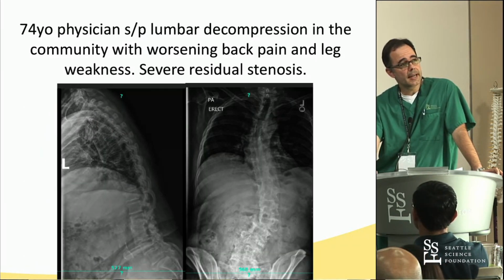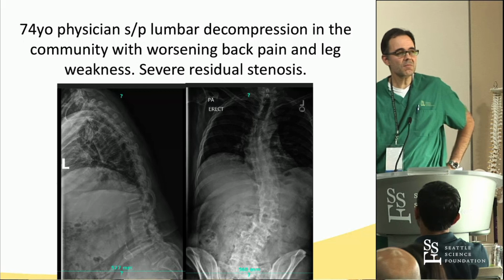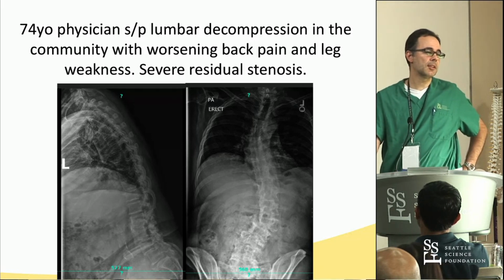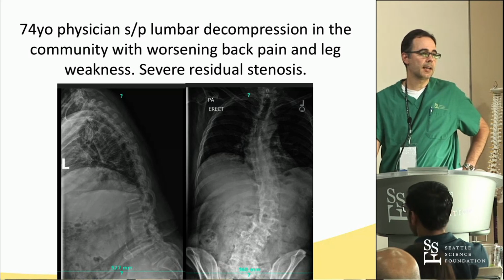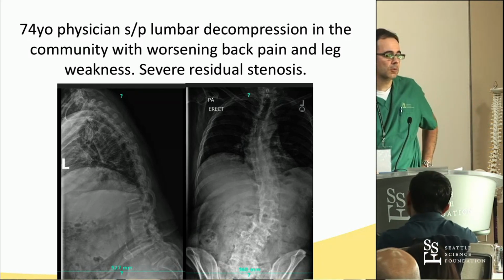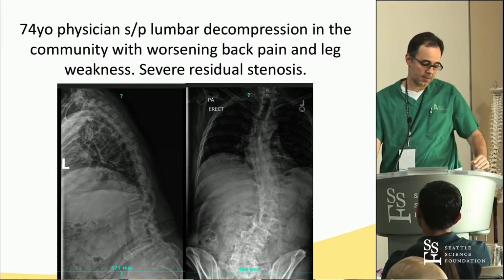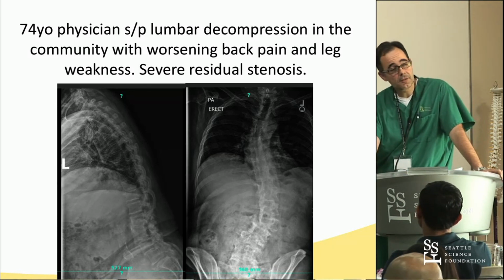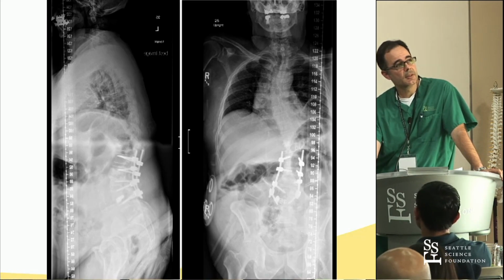So again, another patient with severe, profound sagittal imbalance with significant weakness and pain. My plan was to do a minimally invasive type of procedure to try to minimize his blood loss, and so that's what we pursued.